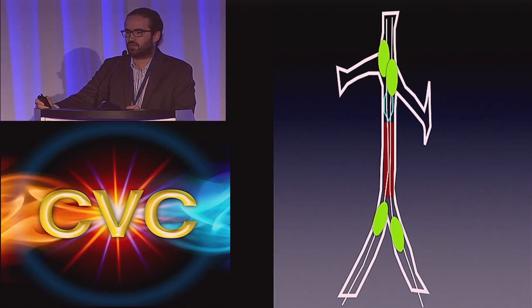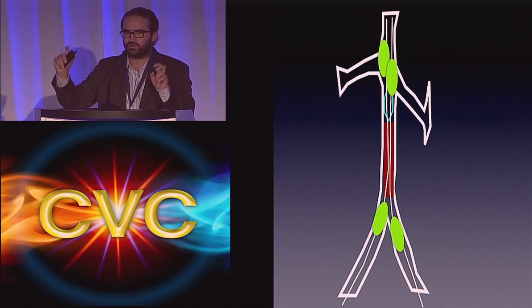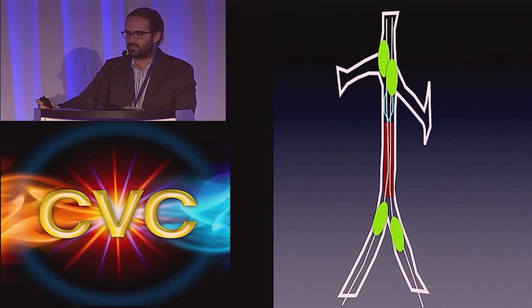There are no trials right now, nor research that I know of, and I'd love to hear from the panel if there's anything, that have actually determined levels of TPA systemically. I do believe that there's probably a whole lot of that TPA that does make it out of that closed, quote-unquote, space that the device creates. And then you activate that device, which starts the oscillating movement.